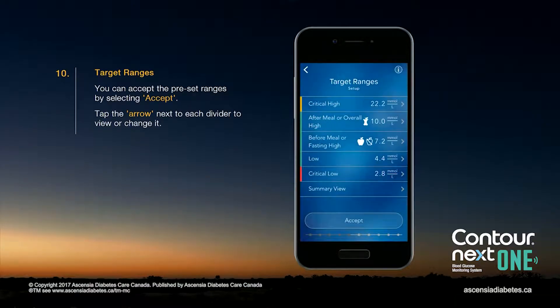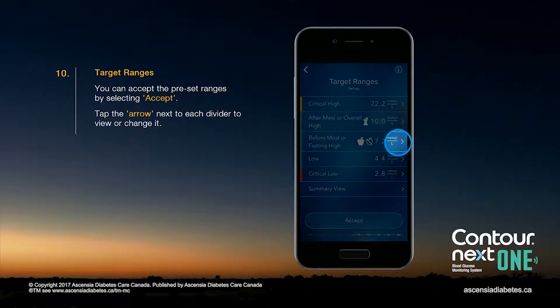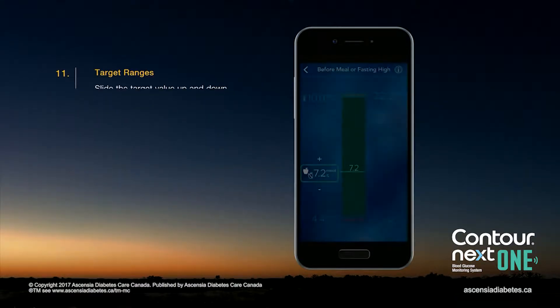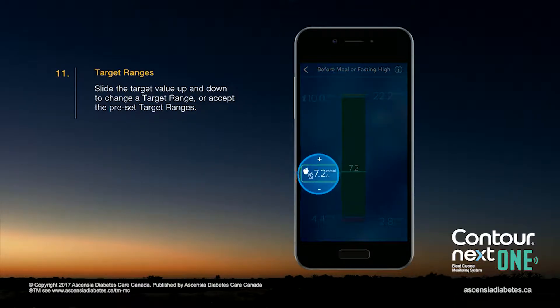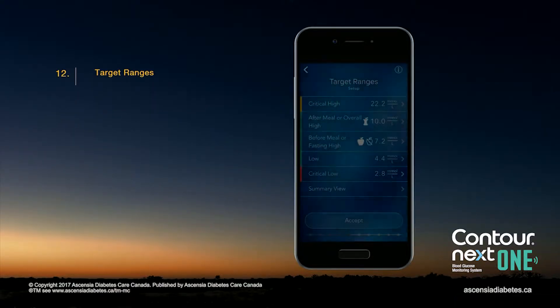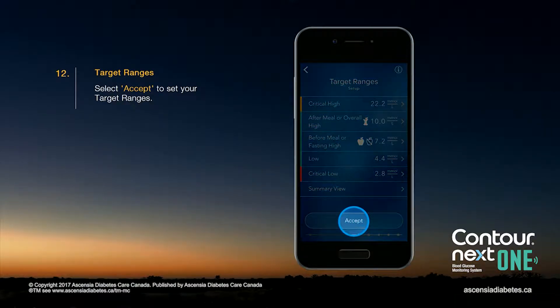You can accept the preset ranges by selecting Accept, or tap the arrow next to each divider to view or change it. Slide the target value up and down to change a target range, or accept the preset target ranges. Select Accept to set your target ranges.